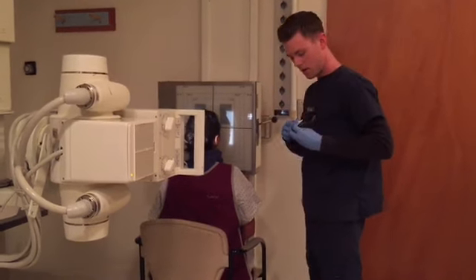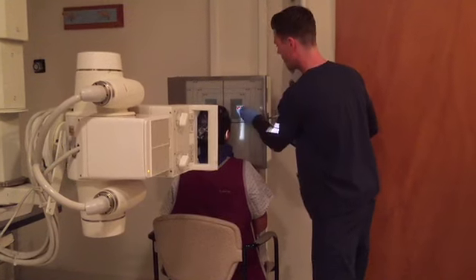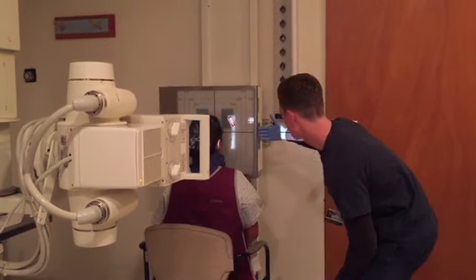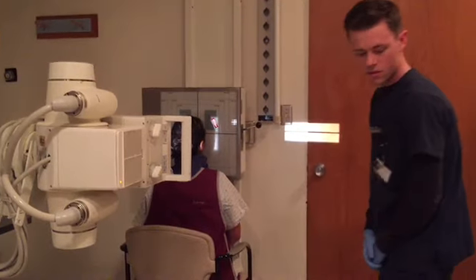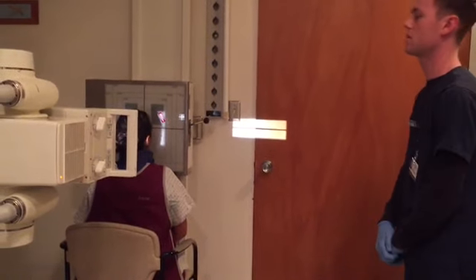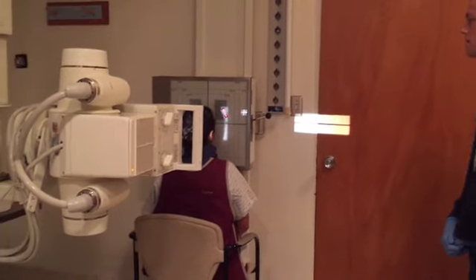I'm going to mark the anatomical side. Perfect. Okay. For this one, I'm going to shoot it at about 70, 75 at about 8 mAs.